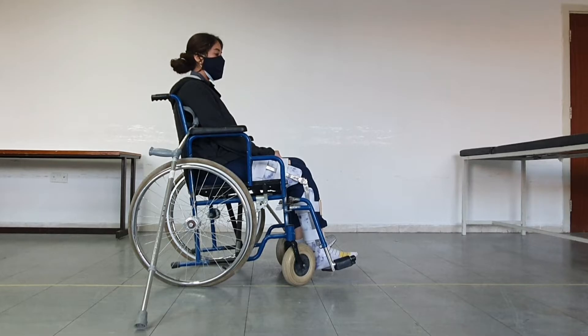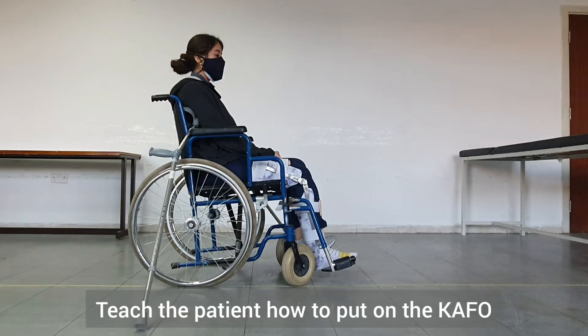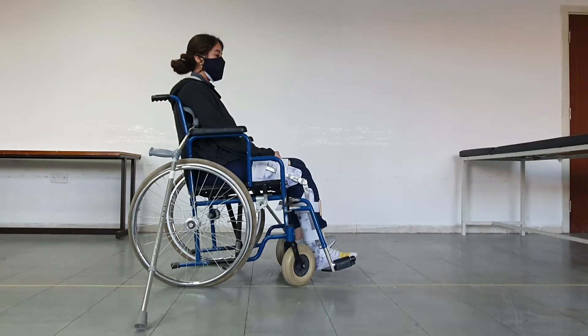One of the skills that we need to teach the patient is to move from sitting on the chair to standing while wearing the KAFO and holding or leaning on the crutches. In order to do that, first we start by teaching the patient to put on the KAFO. This is one skill they need to learn ahead of time — to put the KAFO on and take it off, or what we call donning and doffing the orthosis. The patient has already learned this, so they have the orthosis on while sitting on the chair.